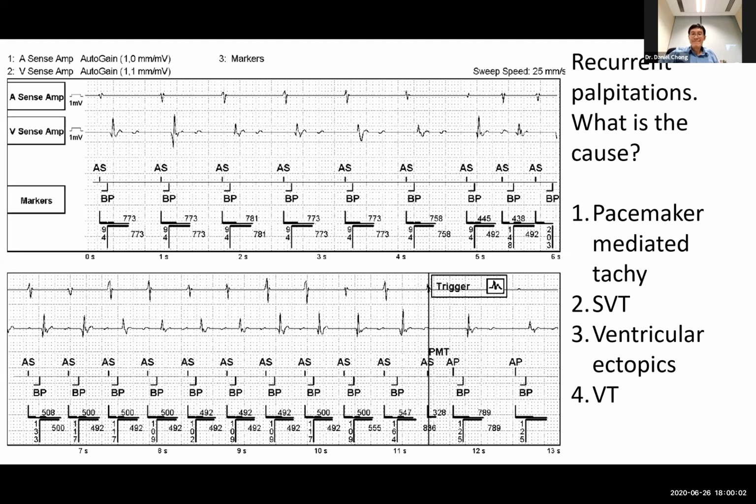Yeah. Great, thank you. Any further comments from Professor Ching? No, I think very excellent questions and good answers. Those are typical PMT responses. And it is safe to defibrillate or shock someone, whether they have a pacemaker or an ICD.